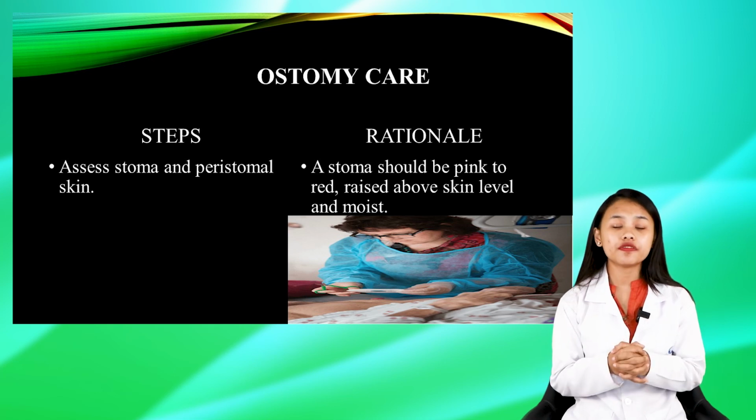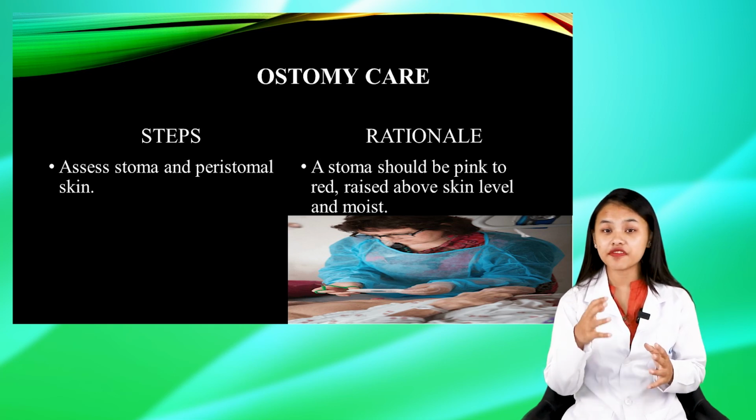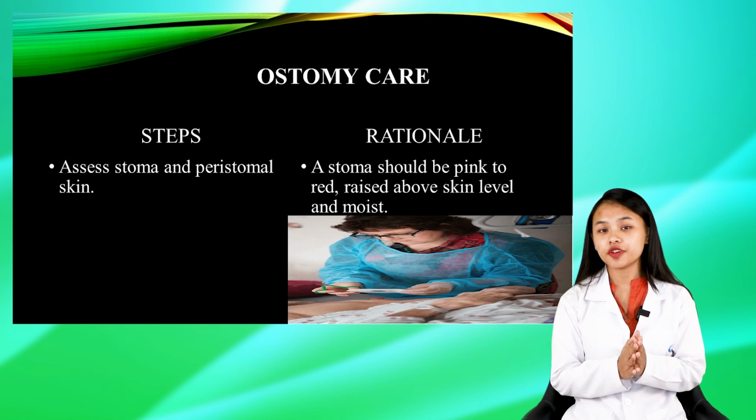It should be free from any infection, wound, rashes, or even skin breakdown. So while you are assessing the stoma and the skin, if you find any abnormalities, it is your duty to report it and notify the physician.